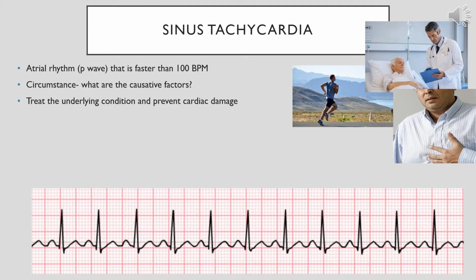This is not a shockable rhythm. There's no need to shock. There's a good conduction throughout the heart. Looking at the rate of this strip down here, you can start at the P or the Q. I like to start generally at the QRS to QRS to QRS. It looks like it's about 2 big blocks and 1 to 2 little blocks. We'll just say that it's 2 big blocks, 2 little blocks. So that's 2.4. We're going to take 300 divided by 2.4, and that gives us 125 beats per minute.